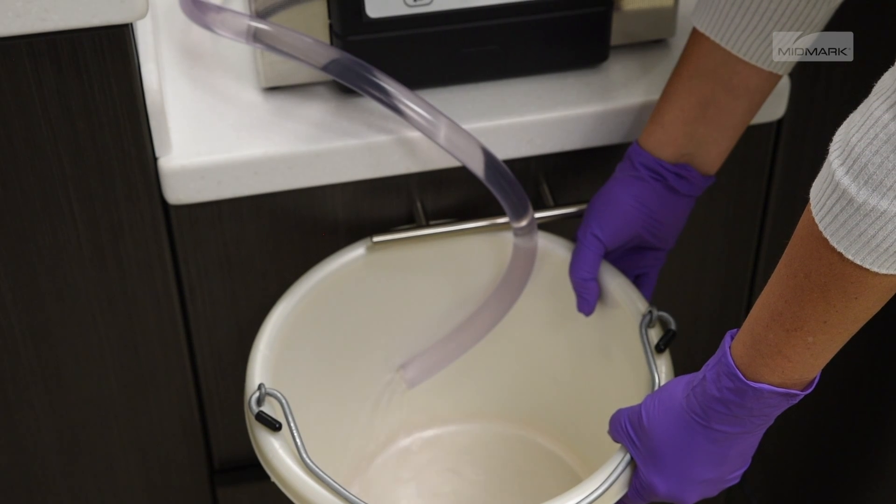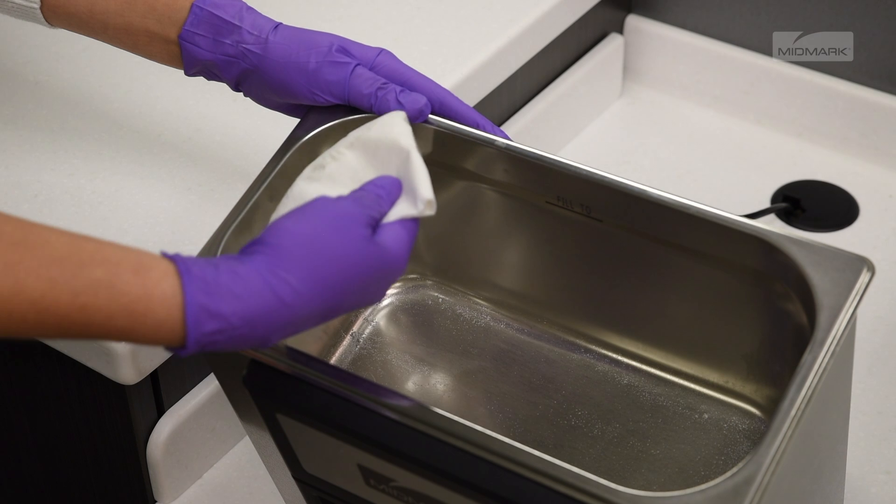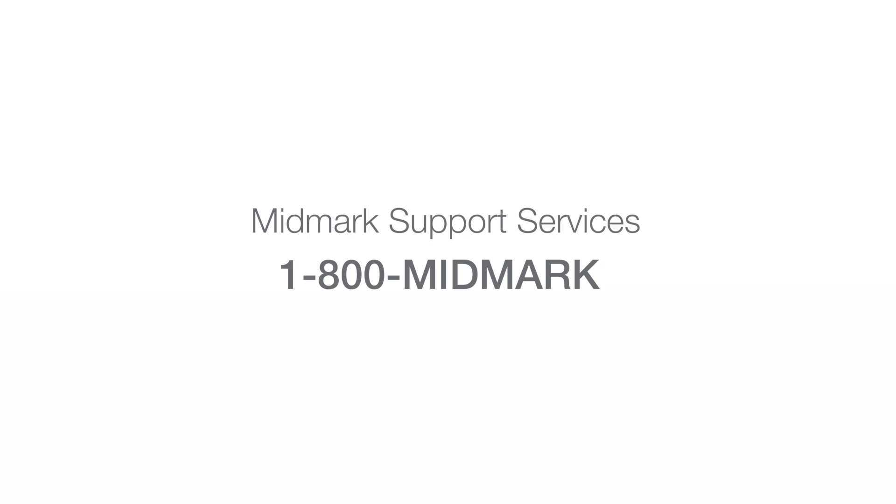Drain and clean the unit prior to cleaning instruments, as the solution left in the tank is foil contaminated. For more detailed information about your ultrasonic, please refer to the Quick Clean User Guide. For further support, contact Midmark Support Services at 1-800-MIDMARK.